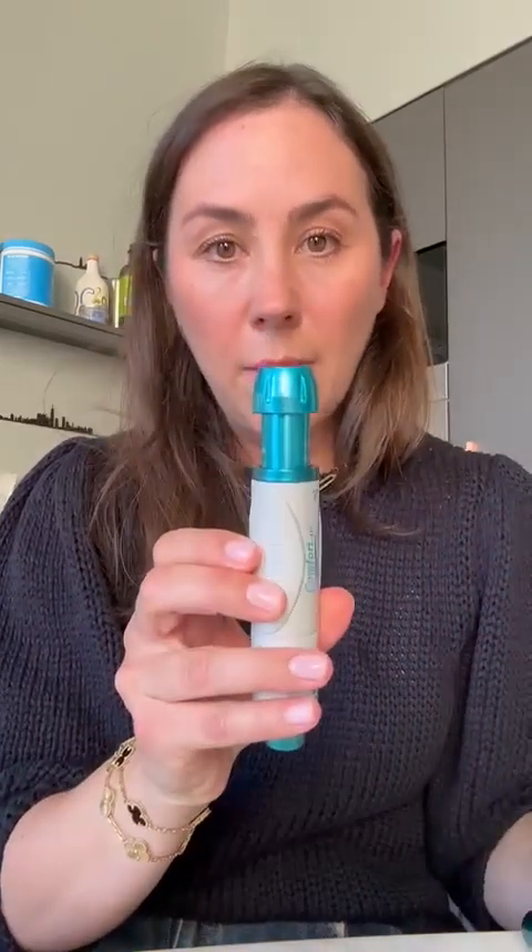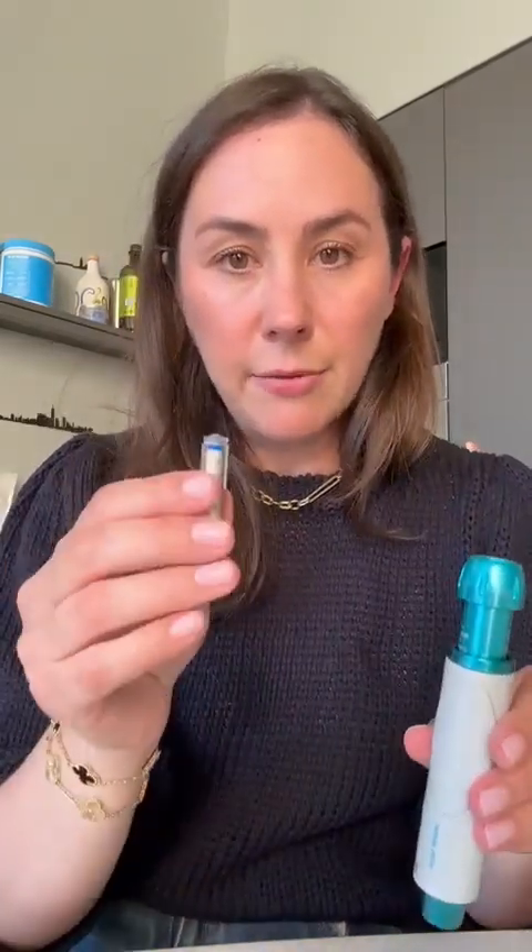I'm going to show you how I prep the Comfort-In injection. I've got the device that pressurizes the Comfort-In, the actual Comfort-In device, the syringe that will get filled with insulin, and the insulin that has a converter top on top of it.